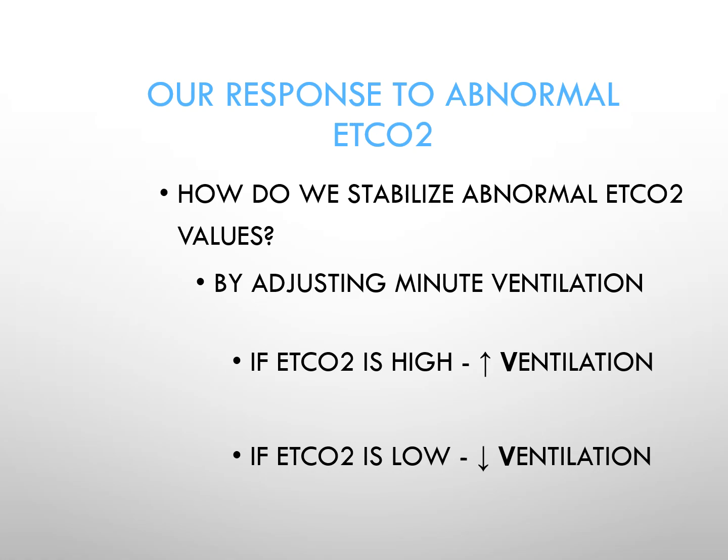If you have room to come up on the tidal volume without imposing excessive stretch on the lungs, you would aim generally in that direction. However, if you're already at a plateau pressure of 29, 30, 31, then perhaps you consider working the respiratory rate, as long as that doesn't adversely impact the IE ratio on the ventilation.